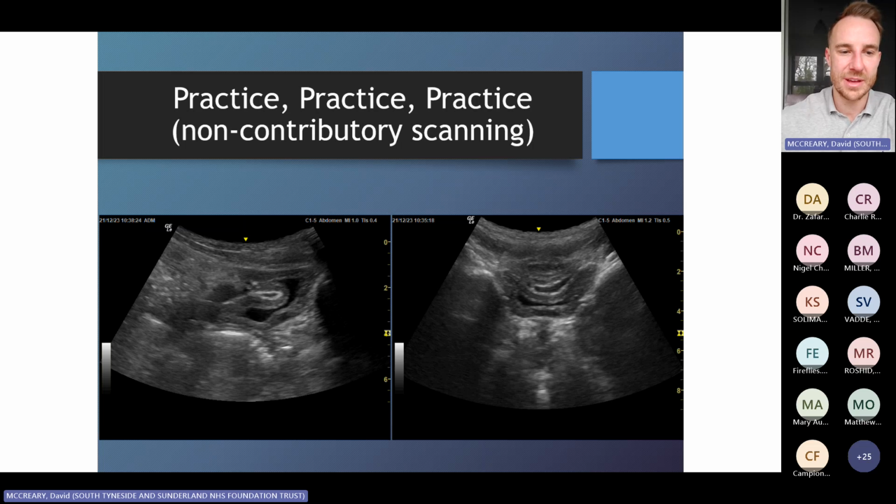and you'll get really good over time. And I think this is one scanning modality where I just caution people a little bit about going away and doing it after today's talk or after any brief bits of teaching. I think you've just got to probably have a little bit of good face-to-face supervision to get decent at it before you do it, as fun as it is. If anyone wants to travel up to our department, I'm more than happy to spend half a day teaching people.